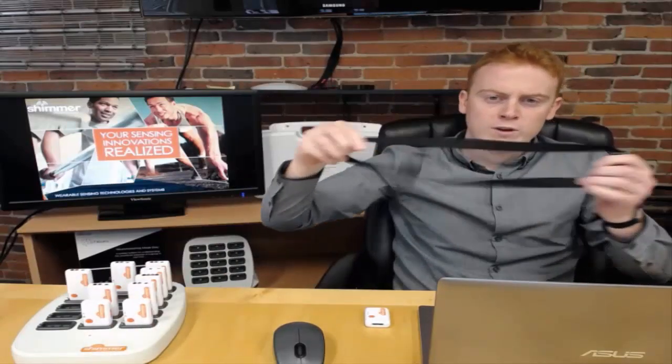Firstly, let's introduce the hardware required to collect data. Beginning with the sensor. As you can see here, the Shimmer3 sensor is lightweight, weighing just 23 grams with dimensions of 51mm by 34 by 14. Each Shimmer sensor comes with a wrist strap and waist strap for positioning the sensor on the body.